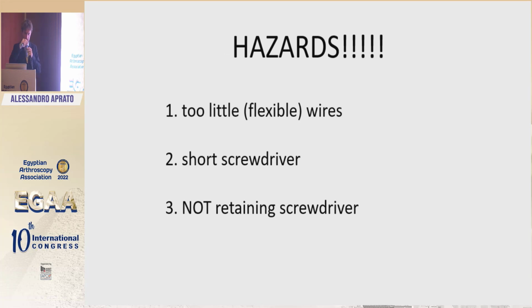If you use little wires, they are too flexible, and you risk breaking them, pushing down the screw. But you need long wires because the skin is, as I said, far away from the head. If you use little screws, which is what we would like to use, you usually have short screwdrivers, so you can't really reach the skin. Sometimes I have to open my portal to reach, with the handle of the screwdriver, the place where I want to be. And the other thing is they are not retaining, so you risk losing your screw while you're screwing it. And that's why I always use a little wire as a cap inside the head.